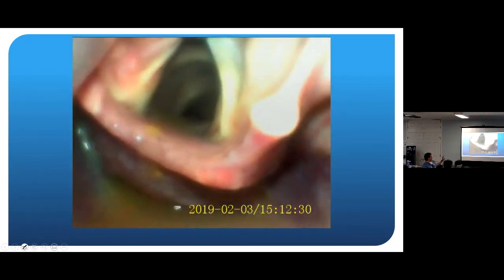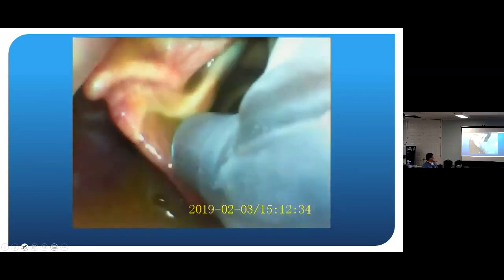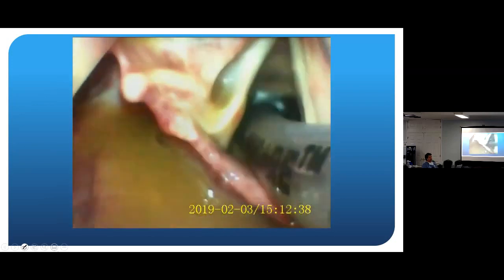And the point of that is that it should be more like this. This was at a nursing home, a little bit faster. In the mouth, there's vomit. You can tell CPR is going on because the chest is moving. And the tube goes in. With video scopes, it makes it a lot easier, right? You can see the hole. Sometimes we get confused and don't go for it soon enough.